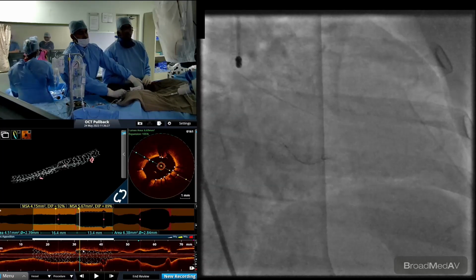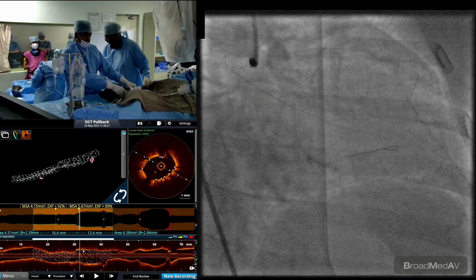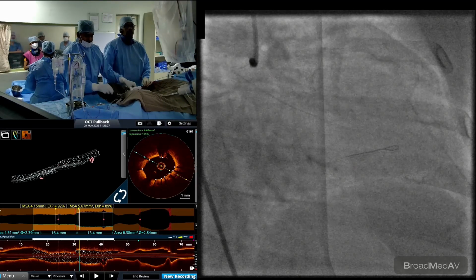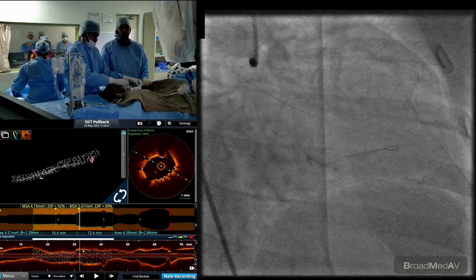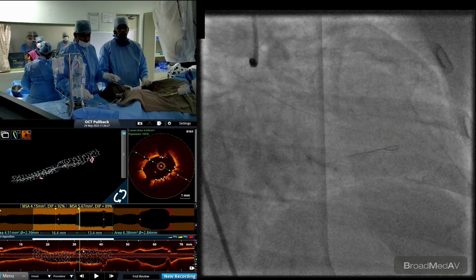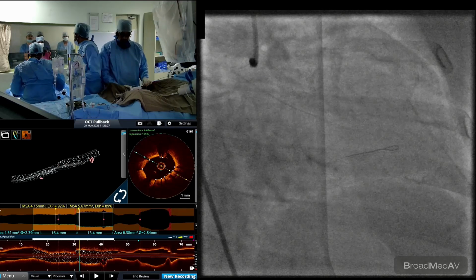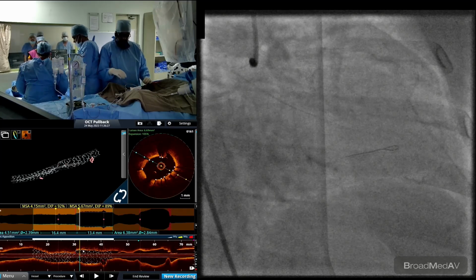Though there is plaque extending up to the ostium of the LAD, we found a good landing zone with the 2.5 balloon at the mid portion of the LAD where the 180-degree arc of EEM is visible. And we sized according to the distal reference diameter, and we did the POT according to the proximal reference diameter. Then we finally checked the expansion, dividing before the diagonal and after the diagonal.